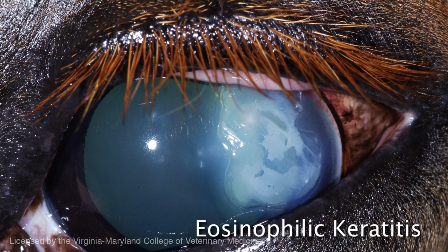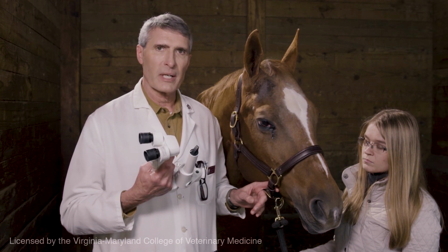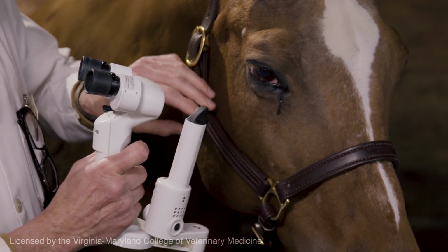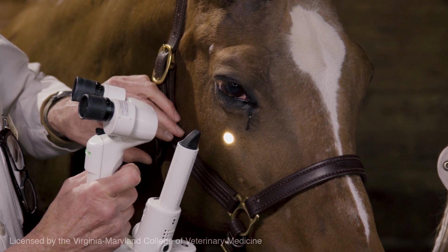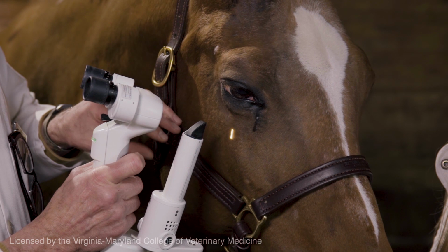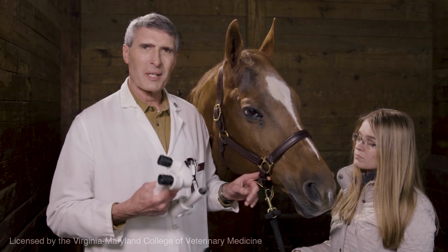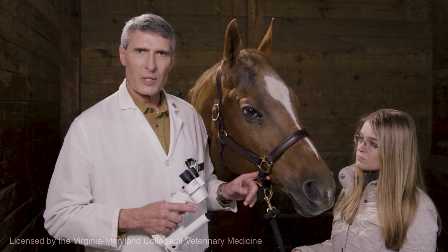The best instrument to use for the detailed examination would be the slit lamp biomicroscope. This is a portable slit lamp. Some people call it a pediatric slit lamp because it is used in little children, and it can also be used in nursing homes and everything. And some people even call it a veterinary slit lamp because we have to use it on our veterinary patients.